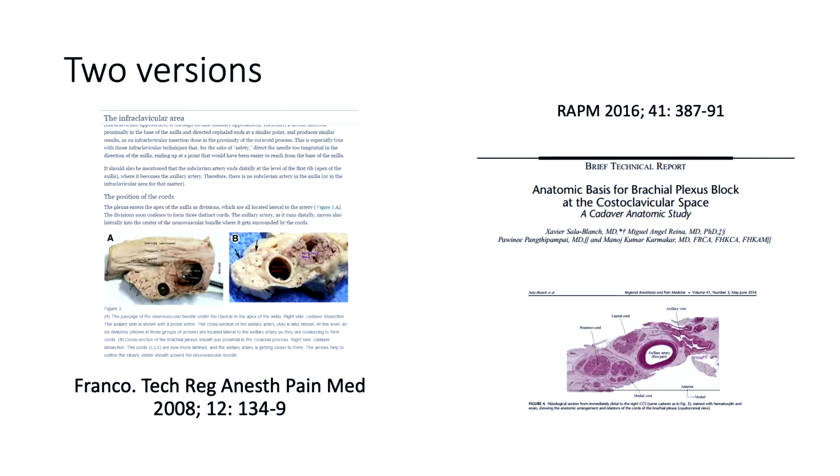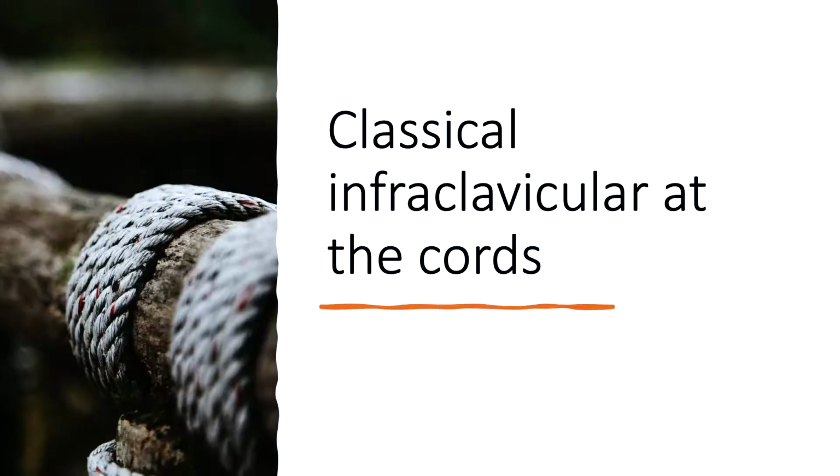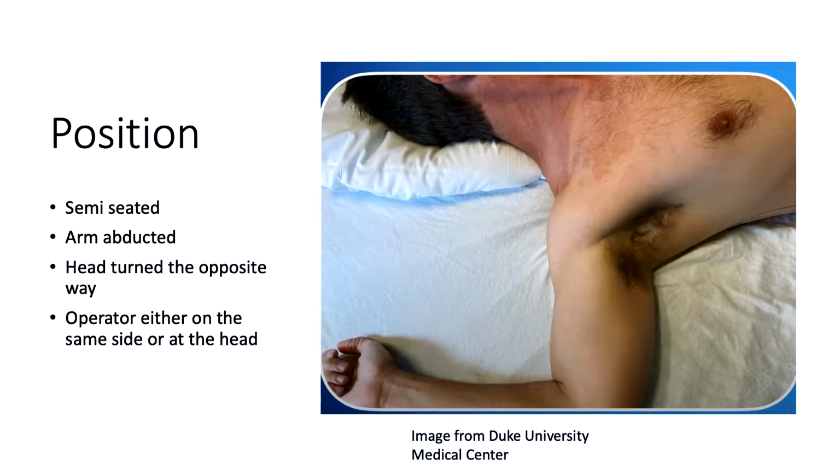Who owns it really doesn't matter, because what matters is that below the clavicle you have the same as at the groin: vein, artery, nerve. With the arm in a slight abduction, you can do an infraclavicular transverse approach right below the clavicle, with the concept of the compartment, without having to go around the axillary artery. Now, if you still like the other approach, it would be a little deeper, because you will have to deal with whatever thickness the pec major and pec minor have in that particular patient.